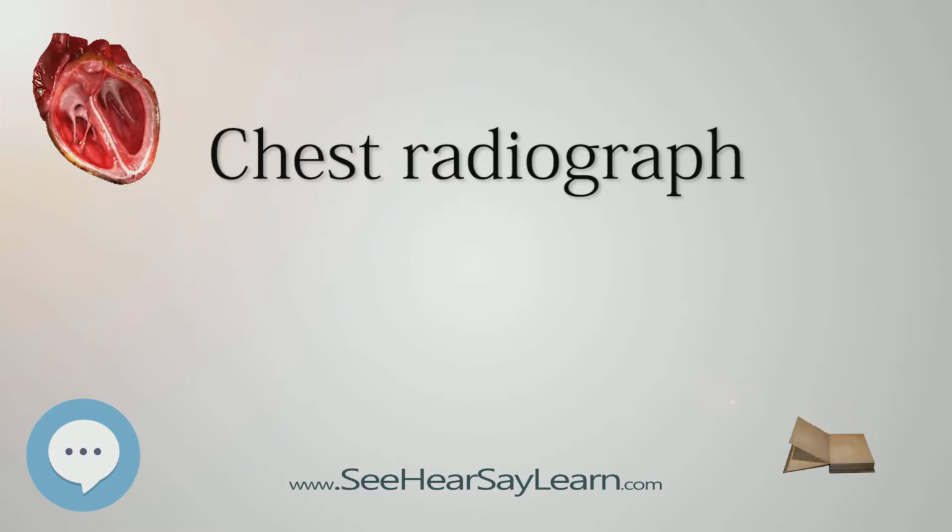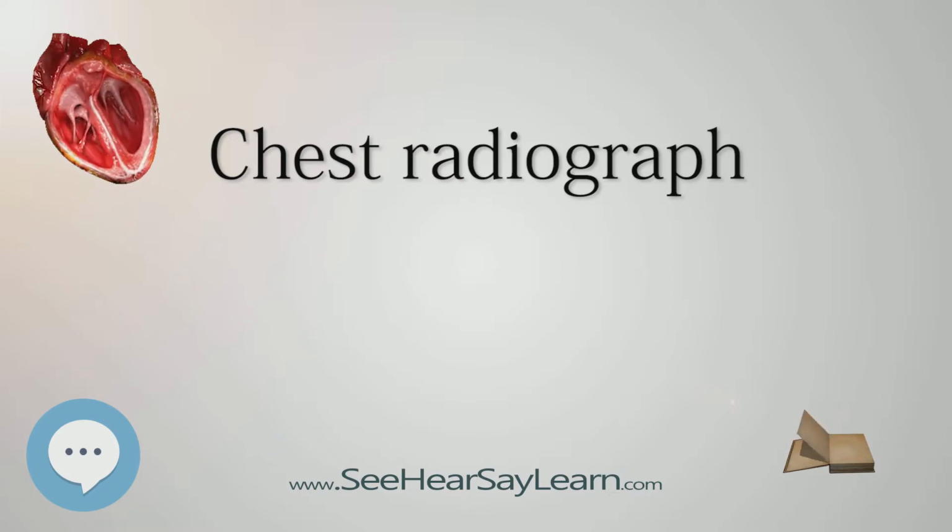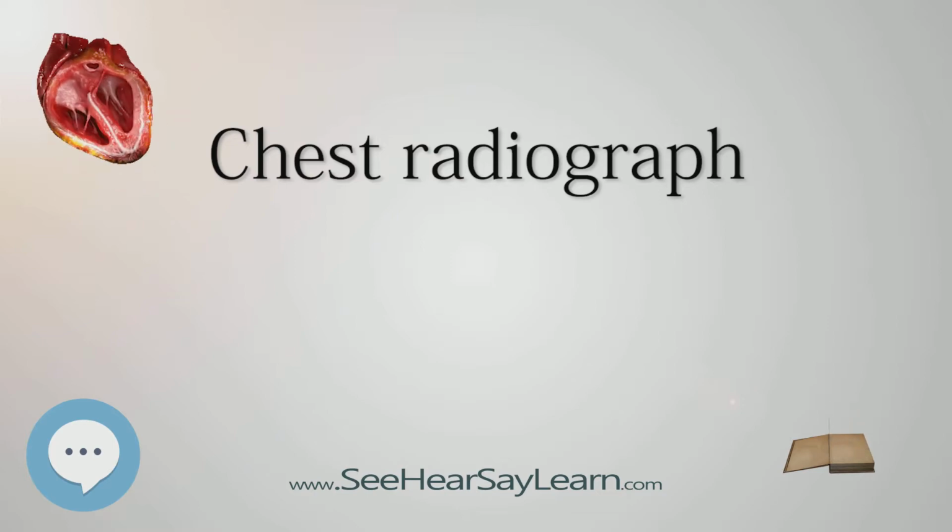Abnormalities. Nodule. A pulmonary nodule is a discrete opacity in the lung which may be caused by neoplasm, benign or malignant; granuloma, tuberculosis; infection, roundish pneumonia; vascular, infarct, varix, granulomatosis with polyangiitis, rheumatoid arthritis.